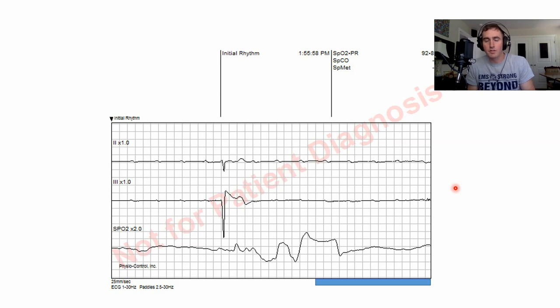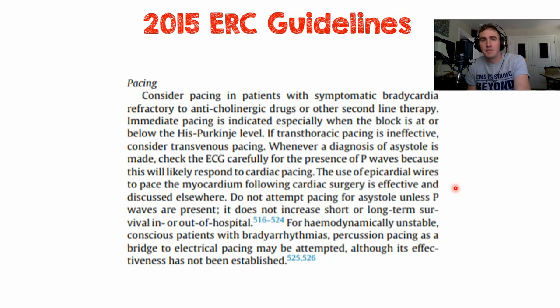She was not responding to pain. And I couldn't feel for a pulse. So, you know, in the heat of the moment, I kind of rationalized in my head, well, I either have to start CPR or I need to pace and I need to get capture. So I quickly applied the pads, and I started pacing. Now, a lot of people would say, well, if you didn't have a pulse, you shouldn't be pacing, right? The 2015 European Resuscitation Council guidelines say that you should consider.